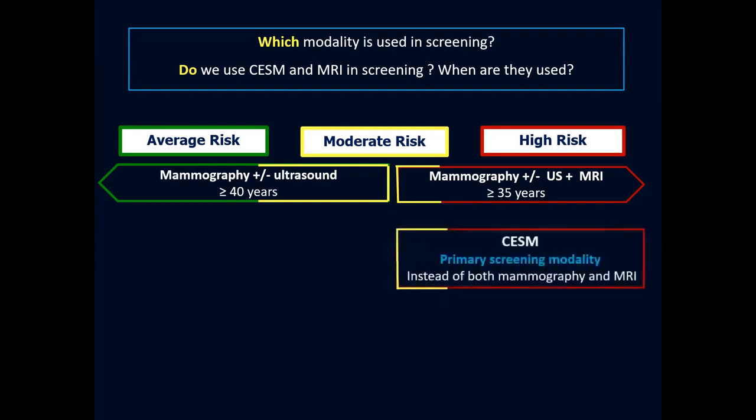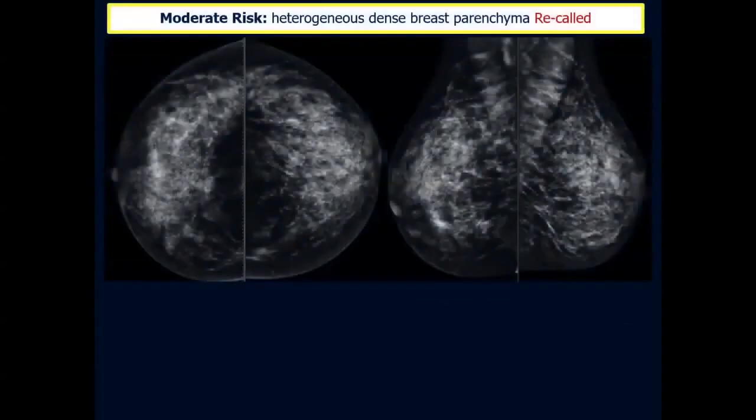And it is here exactly where contrast mammography can compete, because why perform mammography alone and MRI alone when we could get the same information using a single modality, which is contrast mammography. But up till now, there is no sufficient evidence in the literature that contrast mammography can totally replace MRI, and it is used on recalling patients from screening programs and in the follow-up of some selected patients.